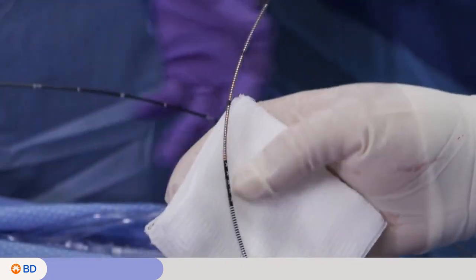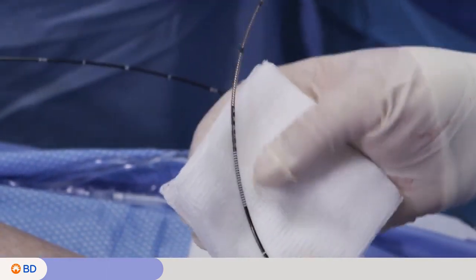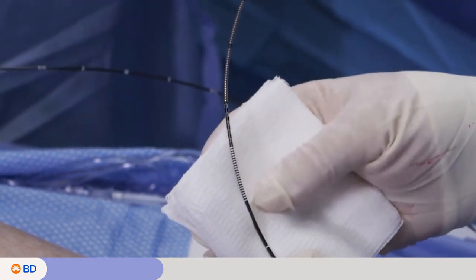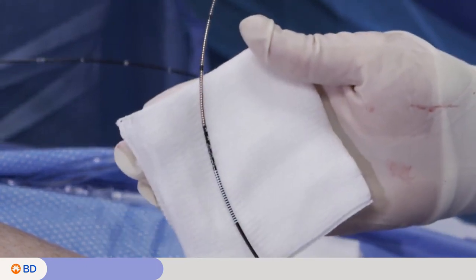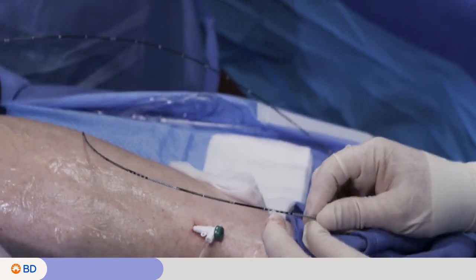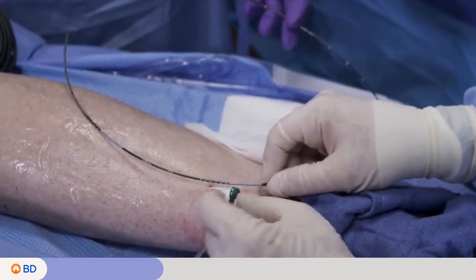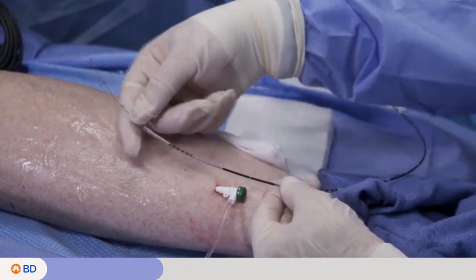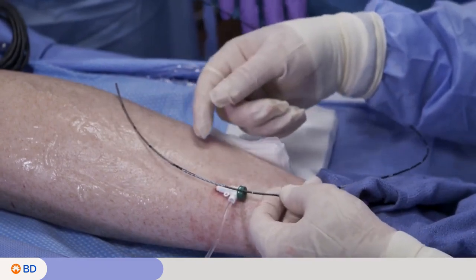There's a warning track here, I call it, with X's at 2.5 centimeters and another with lines to show that you're getting near the end when you're inside the body. So these are very important markers to know. And then we have the back end markers that match to the length of the sheath, so that when it exits here, you'll know where the proximal end of the coil is positioned in the vein.